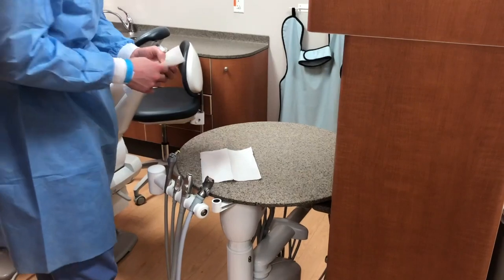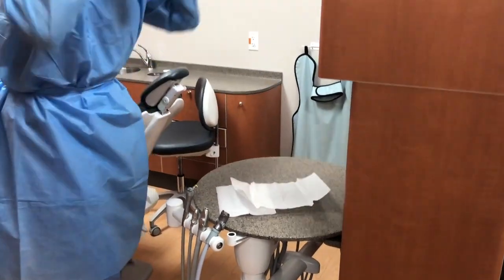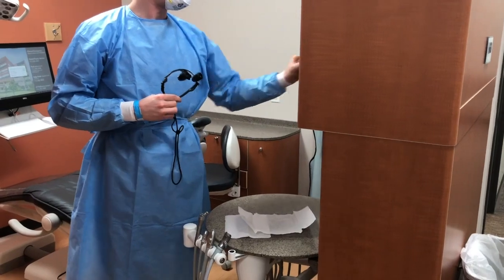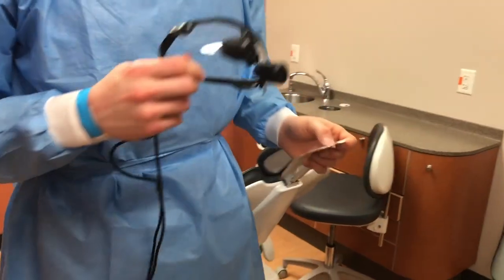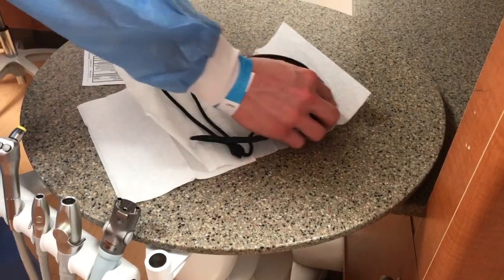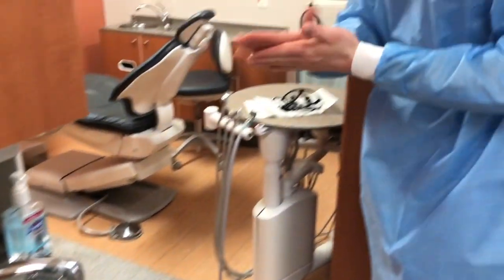Lay down some clean towels — you'll need these to put your loops on. Remove your loops by untying at the back and pulling them off without touching the front of the loops. Clean the loops according to the manufacturer's instructions and then place them down on the clean towels.